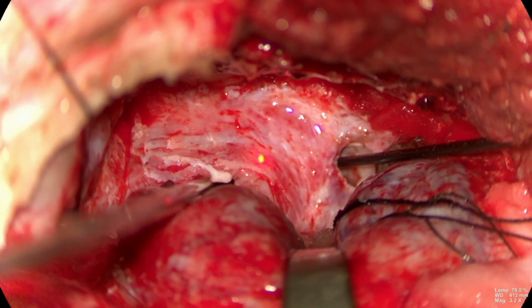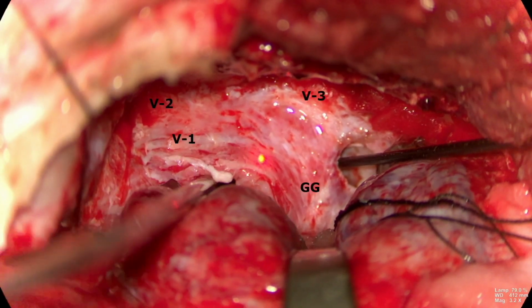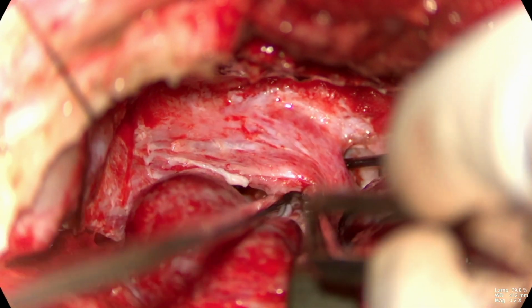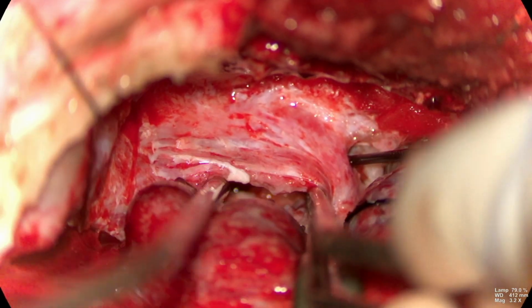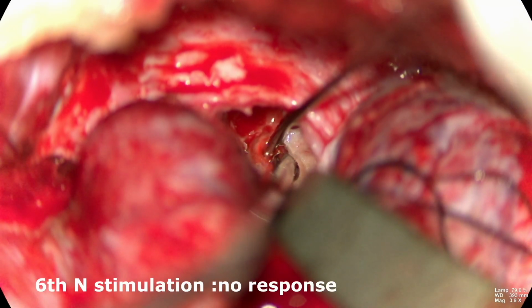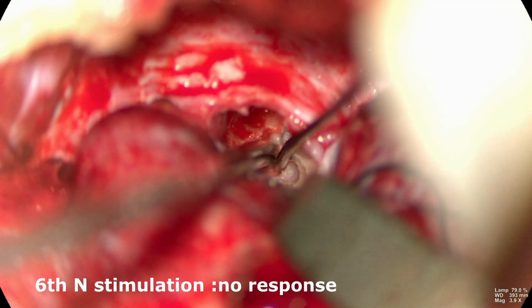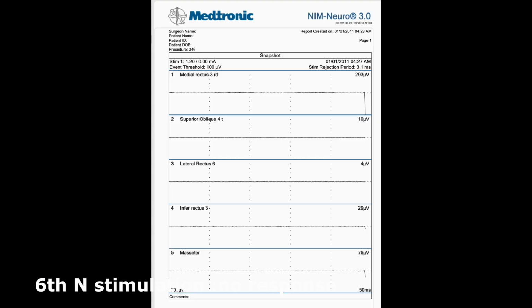We can appreciate all the three branches of the trigeminal nerve and Gasserian ganglion. So we have reached the Dorello's canal area. Sixth nerve was appreciated, but it was not showing any response on triggered EMG, and that was very obvious because the patient was having preoperative sixth nerve palsy.